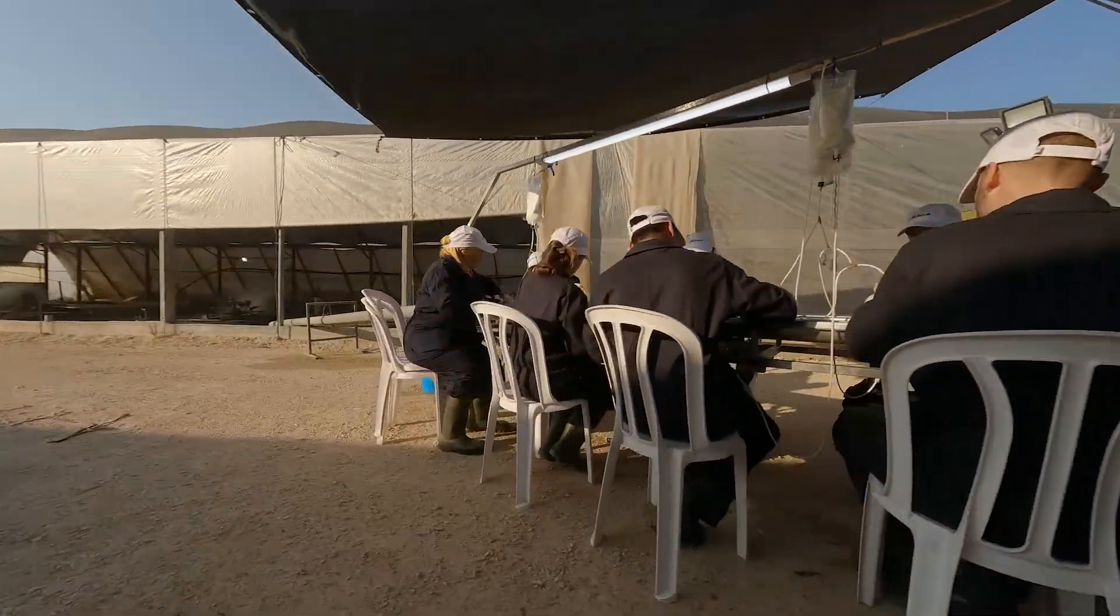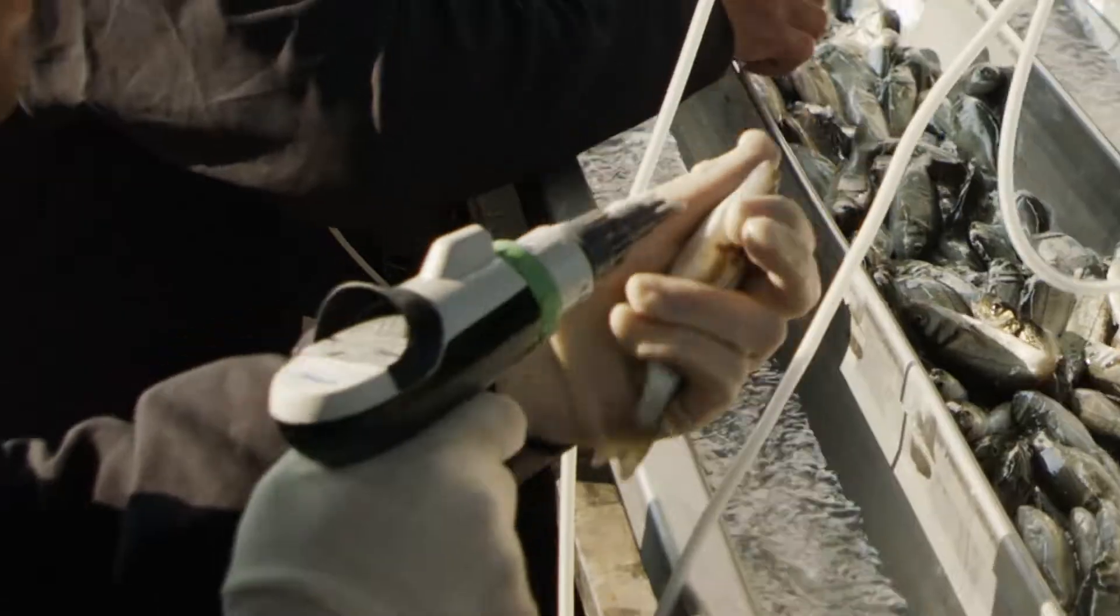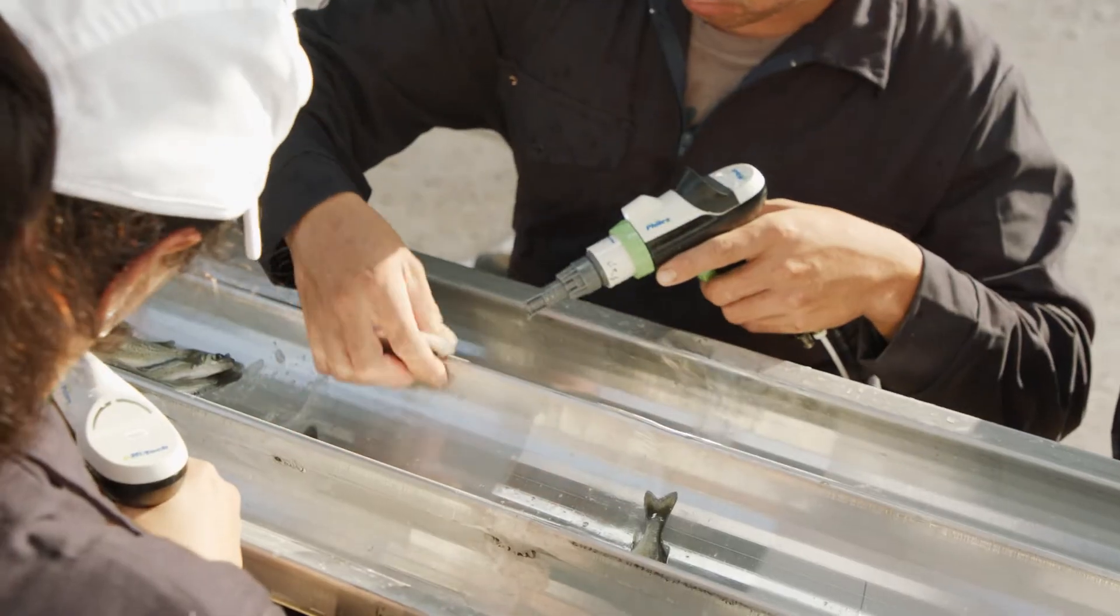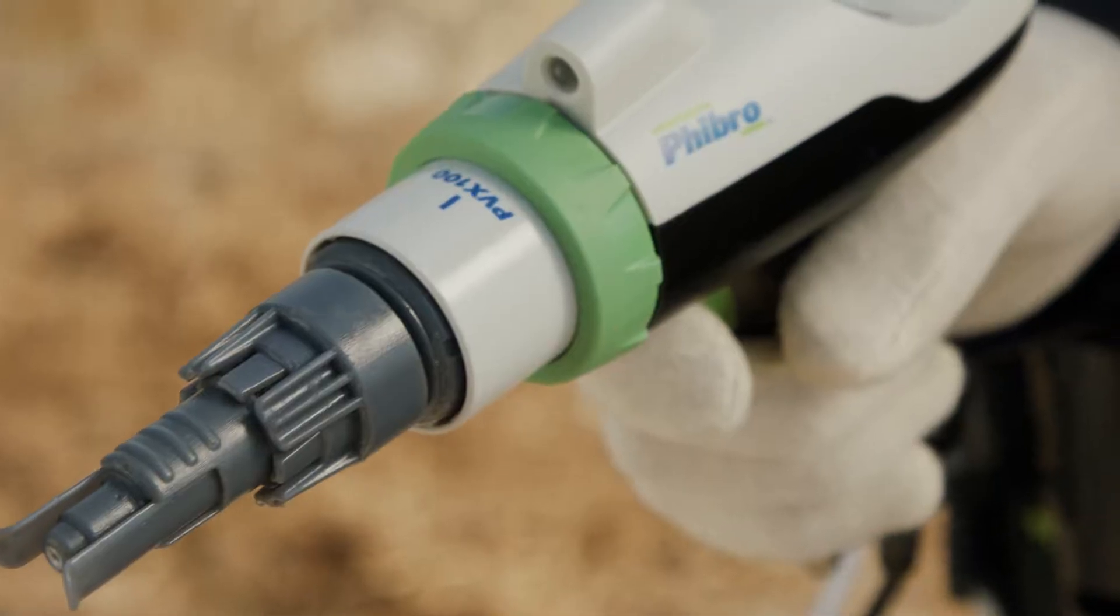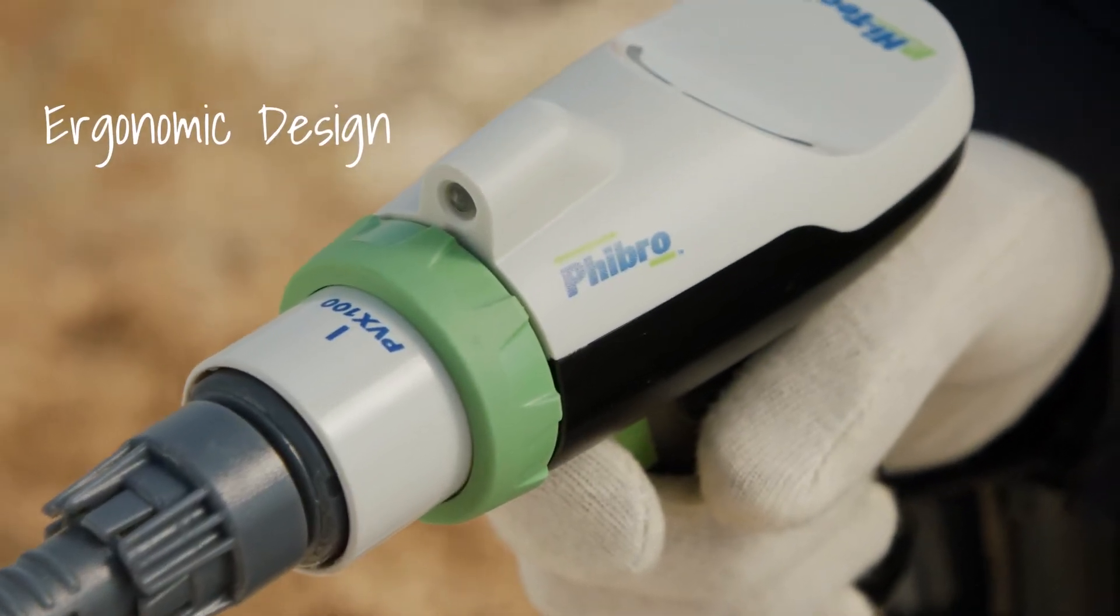Ready to dive into the future of fish vaccination? Wow, look at this new Phytek for Aqua system. Not only does it ensure more accurate vaccination of every fish, but it's also ergonomic and splash-proof.